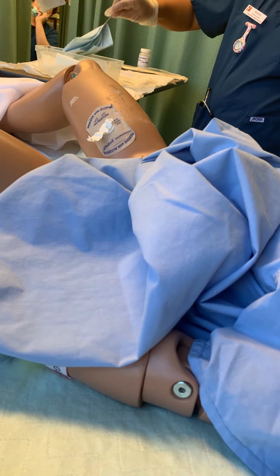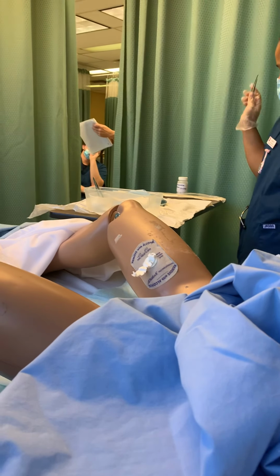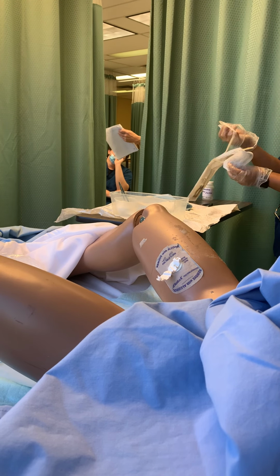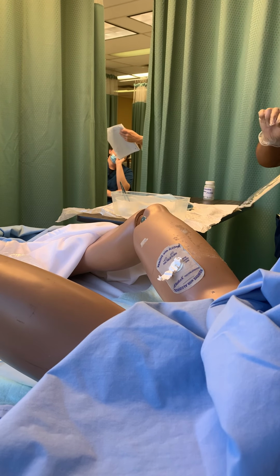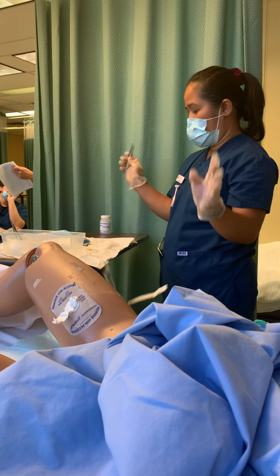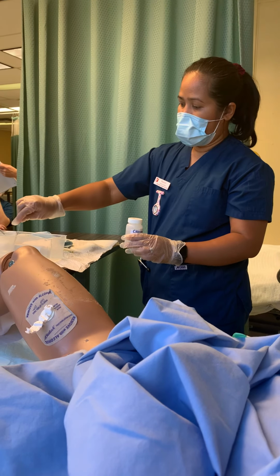I have to inventory my things first before I put them on. This one can stay, so I just leave it there. This one you have to open like a banana peel. This still has a plastic inside, so you just drop it. Then this one, drop. Whatever is in there, don't put your hand down. And this one, be careful all the time.